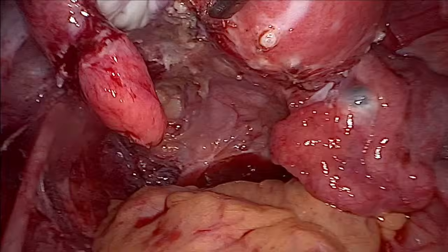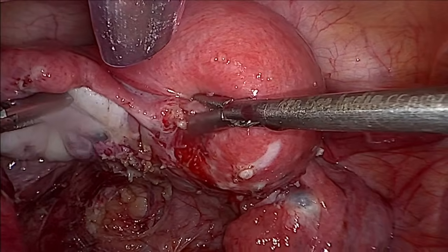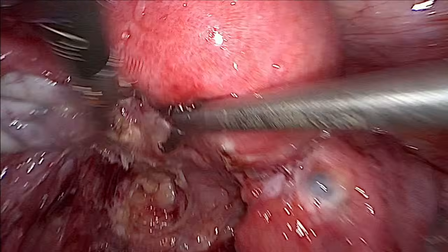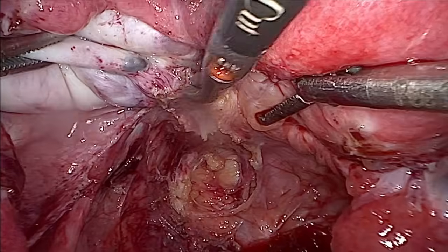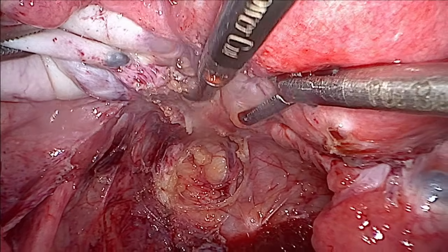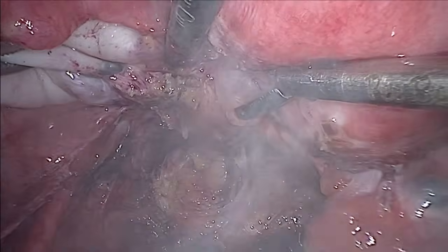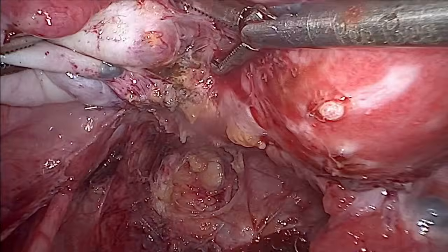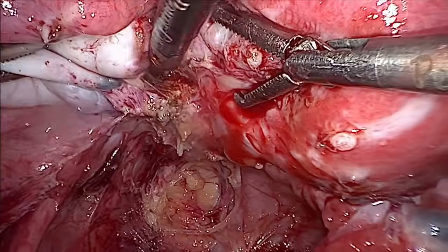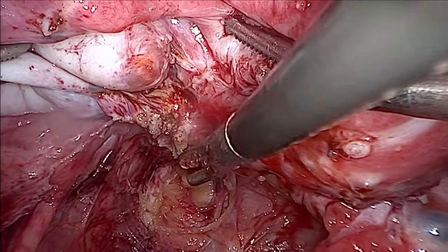Now for adhesiolysis, come up. Very good. So what you can do, you can see the traction given by my assistant. He's pulling towards the left. Now the ureter, the rectum, everything is free. You can just go and cut here. This is all endometriosis here. You go inside and you push.